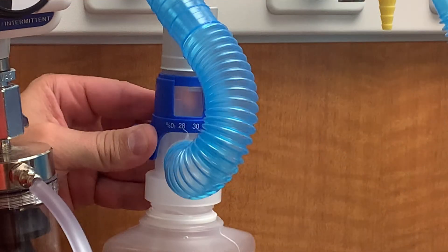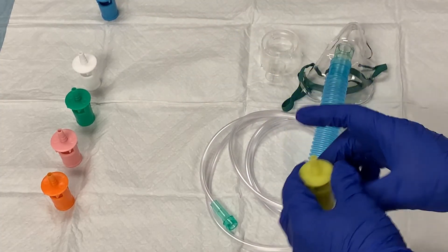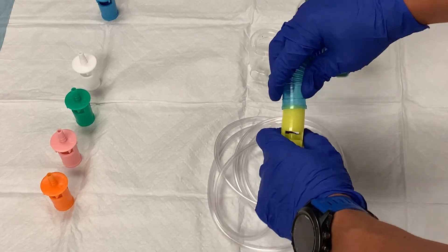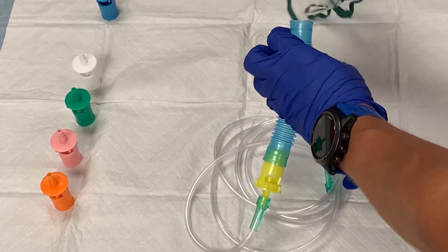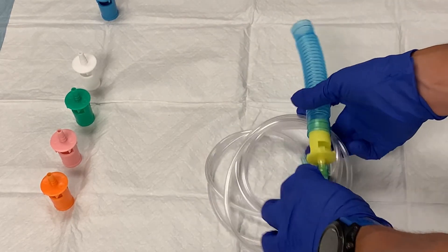Our patient is requiring 28% oxygen to her tracheostomy, so when transporting her, we will utilize the yellow adapter. First, connect the oxygen tubing to the male end of the adapter and attach the opposite end to the blue tubing. Detach the mask from the tubing — you won't need it. You can dispose of the mask and the clear guard that was in the bag. All you will need are the pieces you just connected.